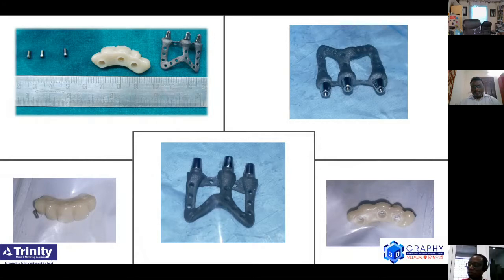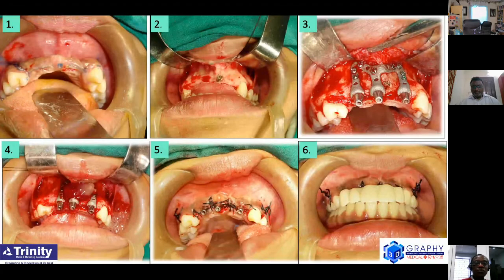You see there, we've taken support from the titanium bars and the abutments which were screw retained. We took up the patient for surgery, a single stage surgery. You see the implants there, the osteoframe being very well seated in that particular area. To enhance the integration capacity, we placed what is called platelet-rich fibrin over the area, and we temporized this particular patient on table.